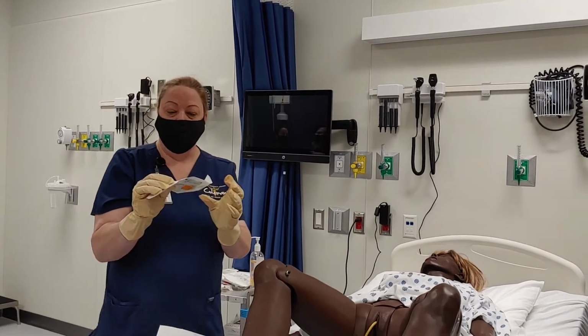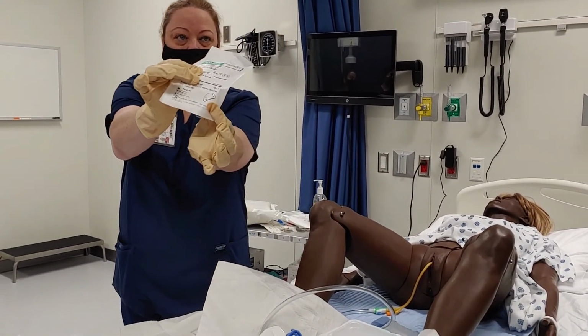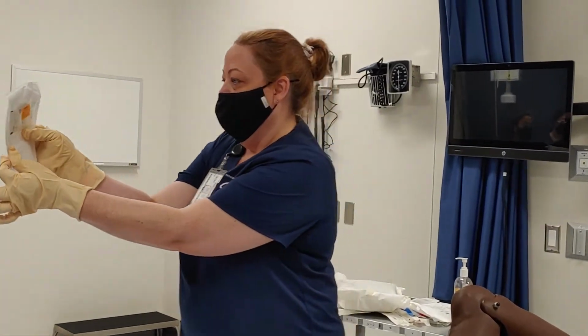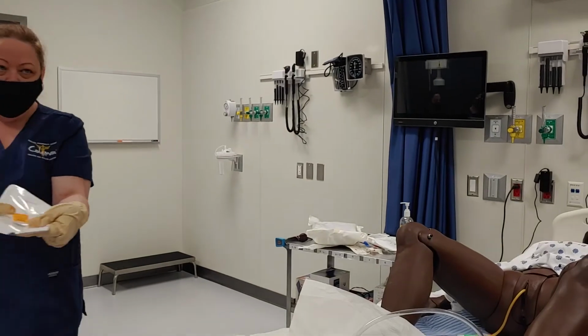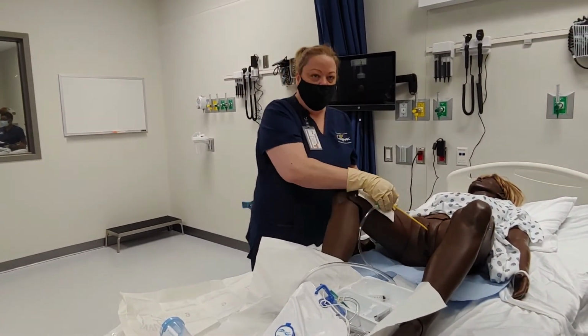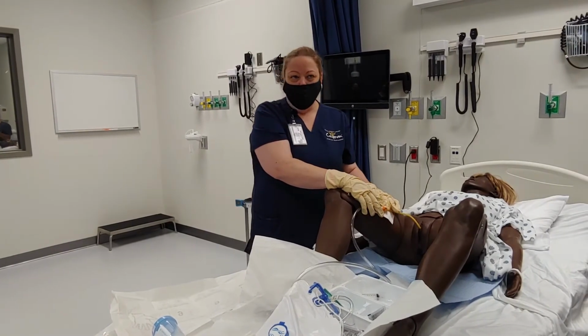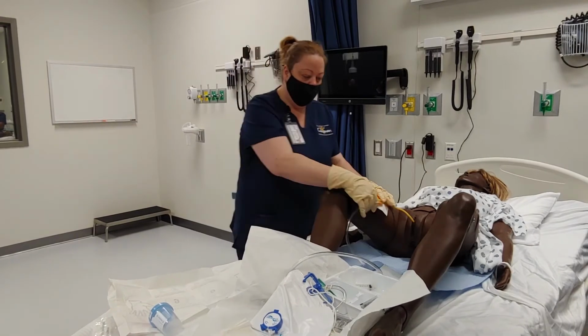Okay, this is a leg strap. Looks just like that. And we're going to put this on the leg. And it's just peeling these off, okay? Just peeling off the backs of the sticker, putting it on the inside of the leg, and attaching this to it. So that when they move and turn over, it doesn't automatically try to yank it out, okay?